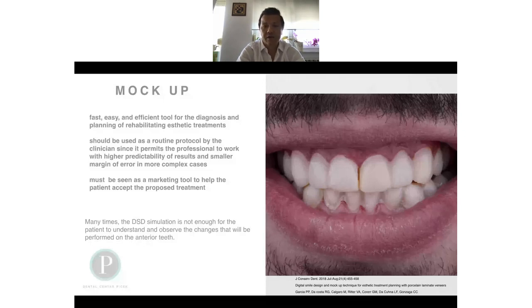Very often before I start, I put the mock-up in the patient's mouth and I say, let's see each other in 2-3 days. And it has a very good influence if he's very satisfied with his family, or his friends where he's living. And if he's in some dilemma, it shows how his dental team had plans for his smile. After 2-3 days, he is coming back to our office and he says, yes, we can start. So I think it's very, very good.